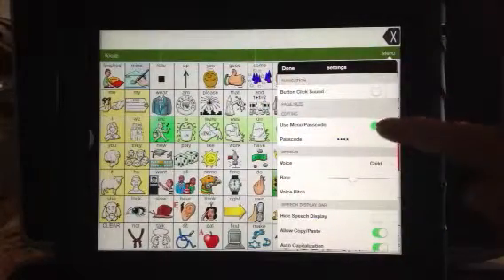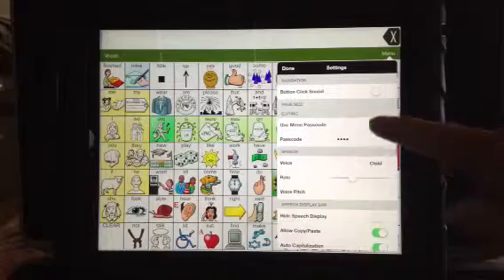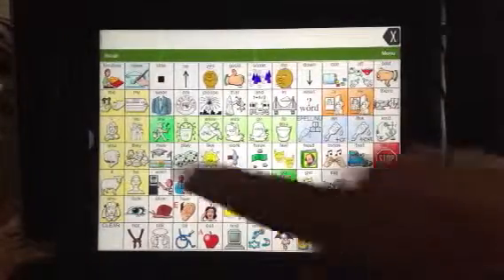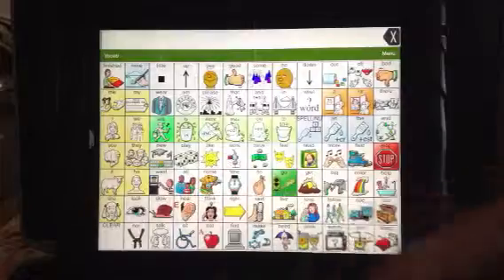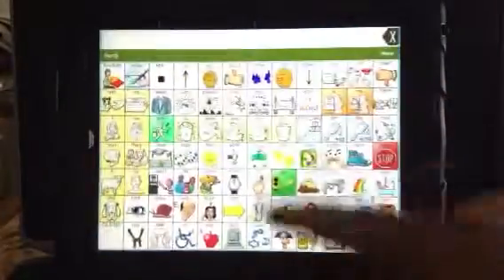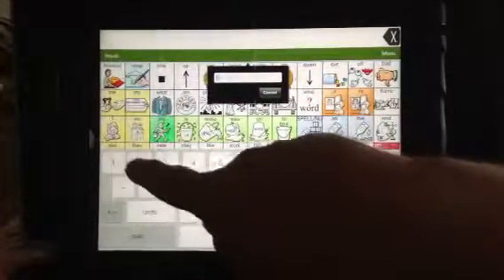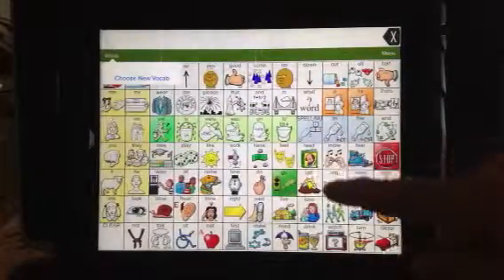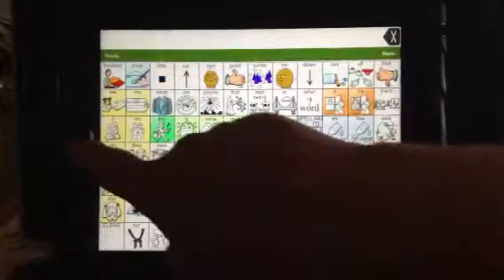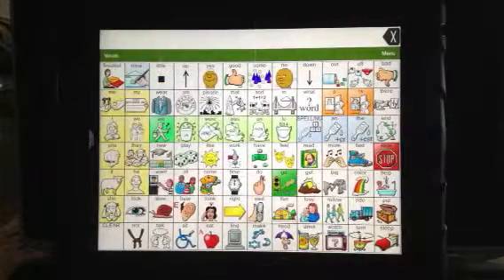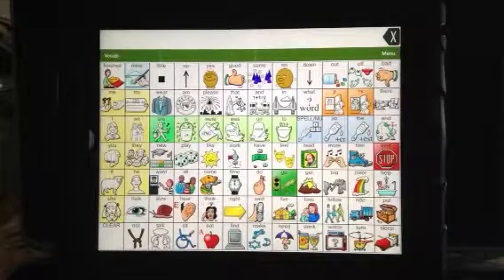The reason I'm not really focusing on this one — that's one way to do it — is the problem with this: if the child hits the Home key, well, they get out of there. So that won't do you much good. It'll stop them from changing things within the app, and they'd have to know the passcode, but it doesn't do you any good if you're trying to keep them in the app. These kids, you know very well, they'll touch this. So what we're going to talk about is Guided Access and how to use it.